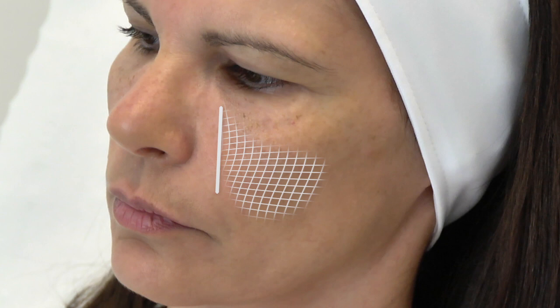The main bolus meets the middle of the tear trough depression, and contiguous boluses are set up based on the physiognomy of the area being treated to ensure harmonious matching with the cheekbone at the back and the lateronasal region at the front.